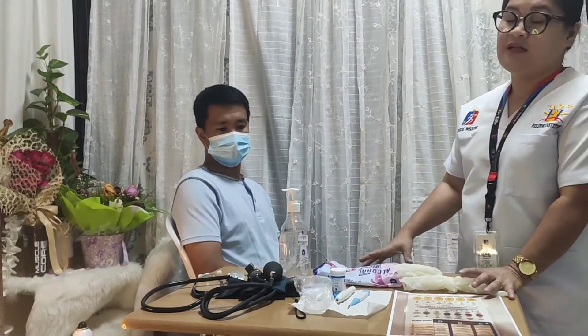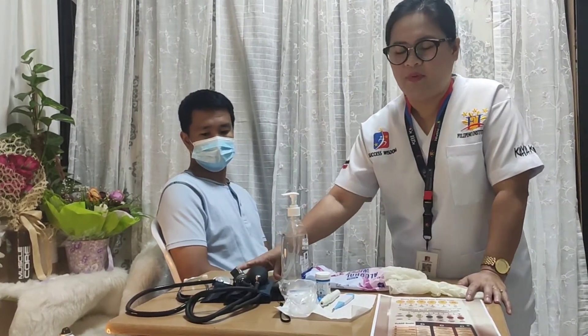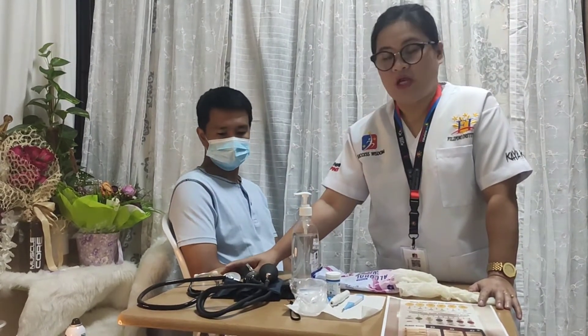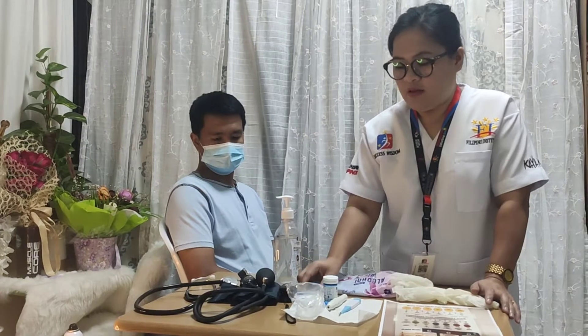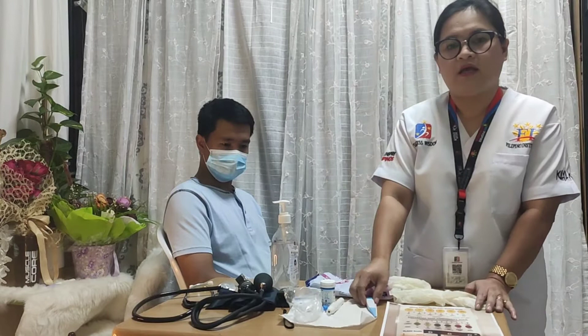Here with me are all the vital sign equipments. I made sure that they are all clean and functional. I have with me the blood pressure cuff, or we call it a sphygmomanometer, to check the blood pressure. I have the stethoscope to check the heart rate, and the pulse oximeter to check the oxygen saturation. I also have the glucometer to check the blood sugar level, and different kinds of thermometers: digital, tympanic, and infrared.